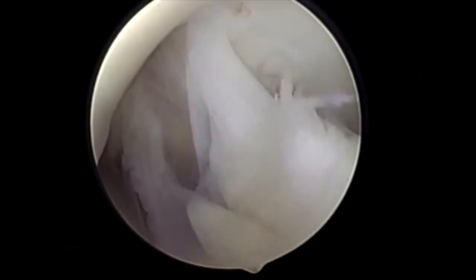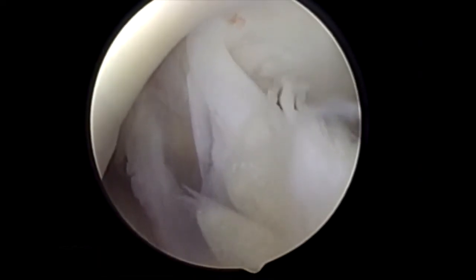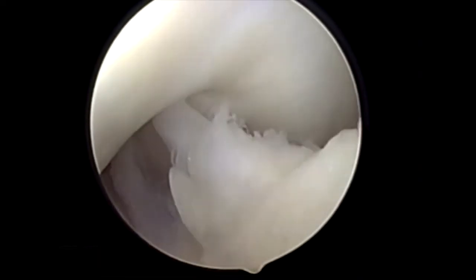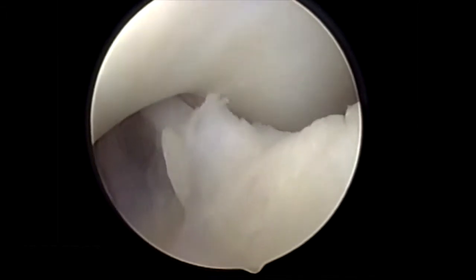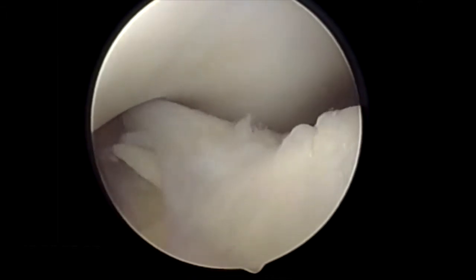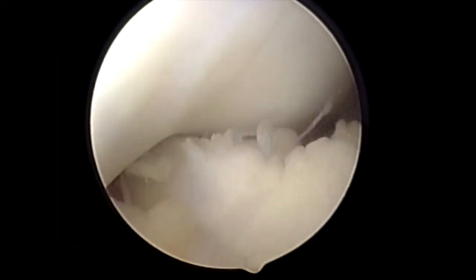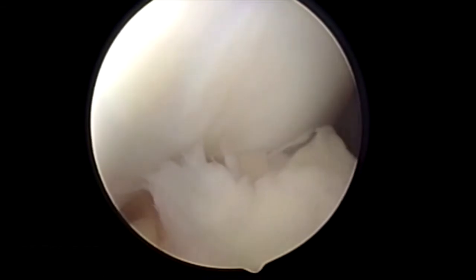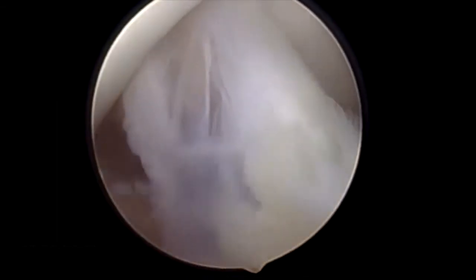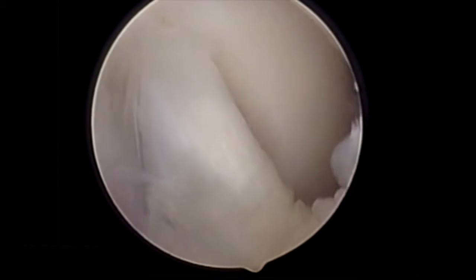From a relaxed appearance in mid-arc, the IPP tightens as it approaches the apex of the notch, contacts it, and rotates out of view, as the fat pad then contacts the trochlea. In full flexion, the IPP tightens and becomes vertical.